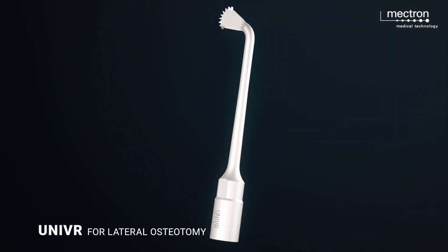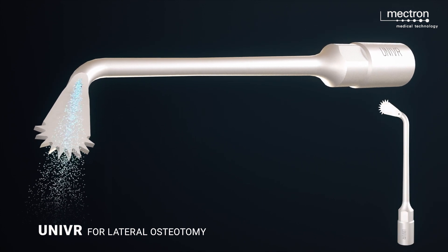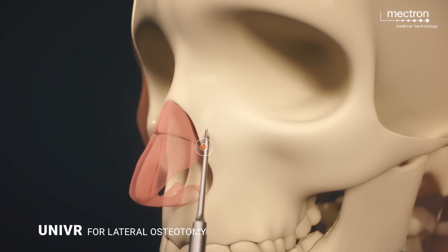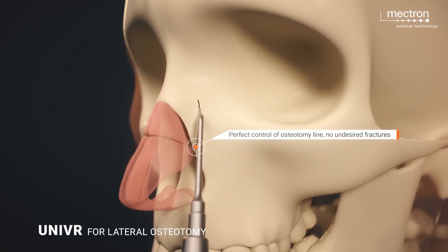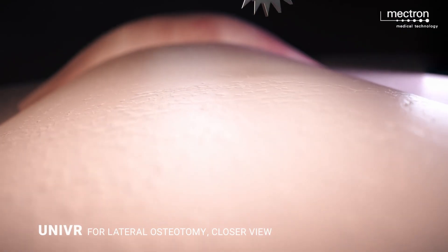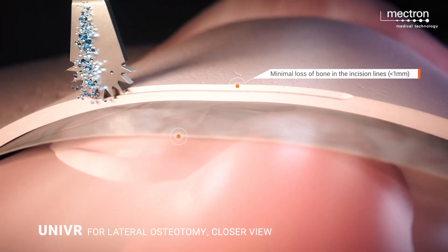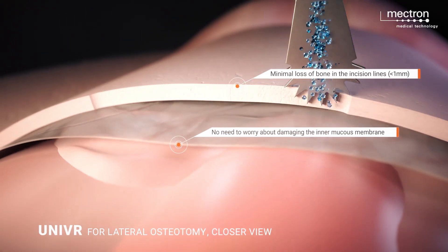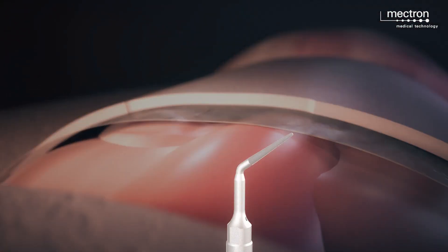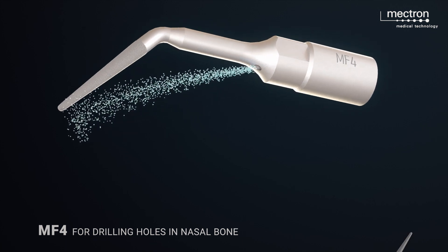The universal inserts can be used for lateral osteotomies. It is a great advantage of piezo technology that soft tissue such as the nasal mucosa is not damaged when the instrument is used appropriately. The MF4 inserts can be used for drilling holes in the bone.